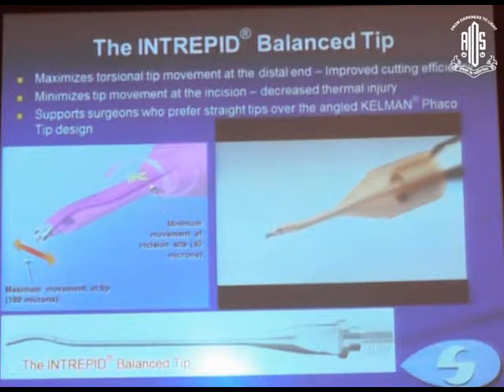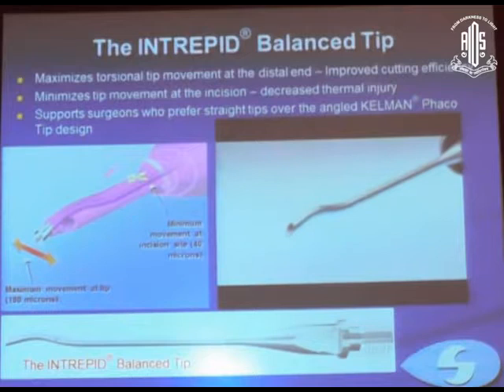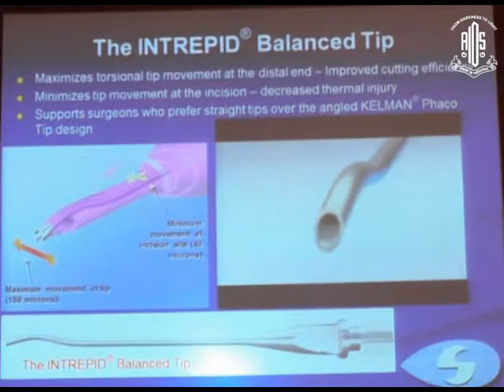And now this is the new balanced tip which has been introduced in this machine. You can see it's a very funny type of tip, it has got a hump in it and looks very odd. The good thing is that it maximizes the movement at the tip. This is normally 140 microns, whereas this tip has become 180 microns, that is the lateral movement. Whereas the movement at the incision side still remains the same, that is 40 microns. Therefore, there is improved cutting efficiency because there is more movement at the tip. However, there is decreased thermal injury because there is less movement at the incision.